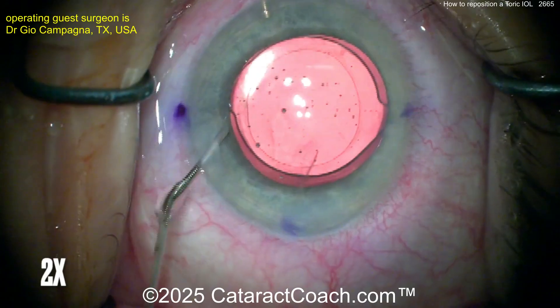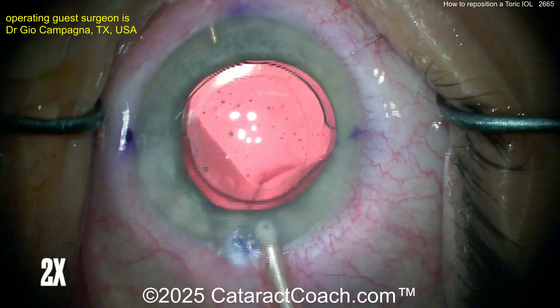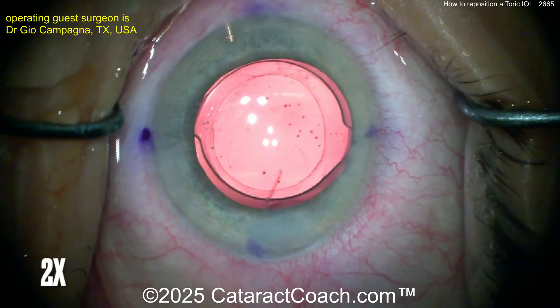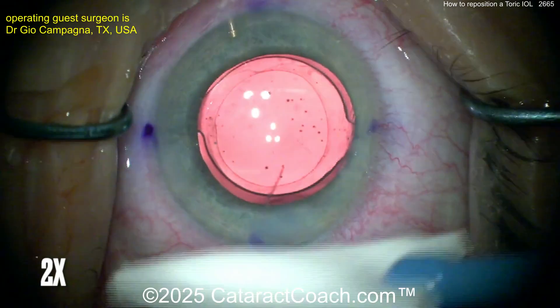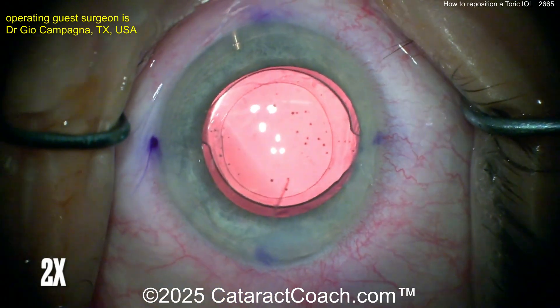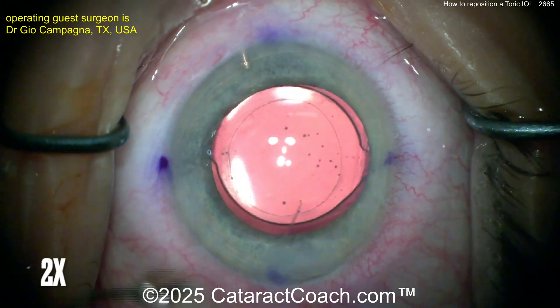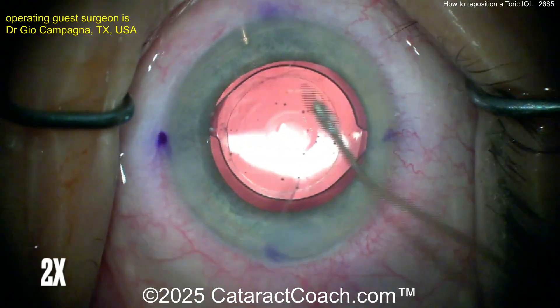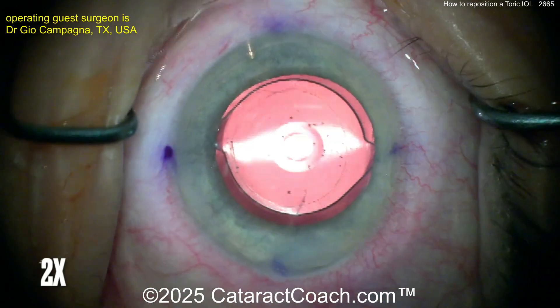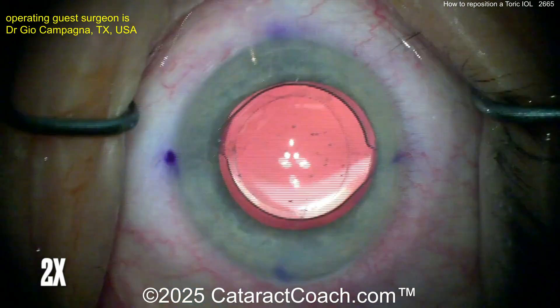Now the toric lens is in good position — you should have a nice refractive outcome and be able to address all that astigmatism. Again, it's sometimes helpful to put a CTR in these eyes to keep the capsular bag more stable. Now sealing up the incisions. The other eyes we tend to see this in are very large myopic eyes. These acrylic lenses do have a tacky surface that helps hold them in place as the eye heals. However, this eye already had contraction of the capsular bag, so you may not have the same holding power as in an original cataract surgery where the bag shrink wraps down much more.